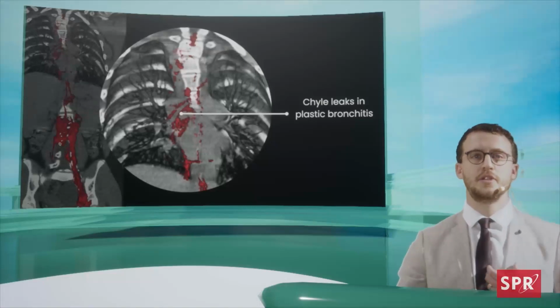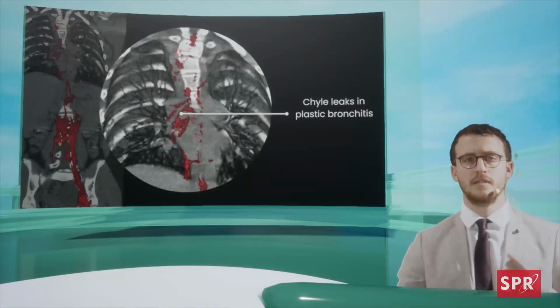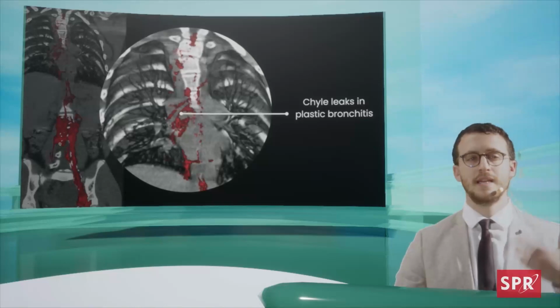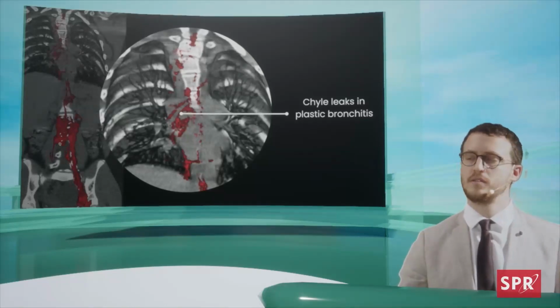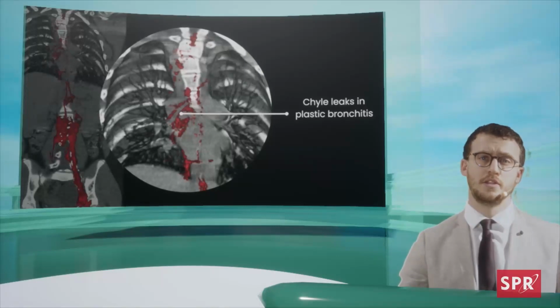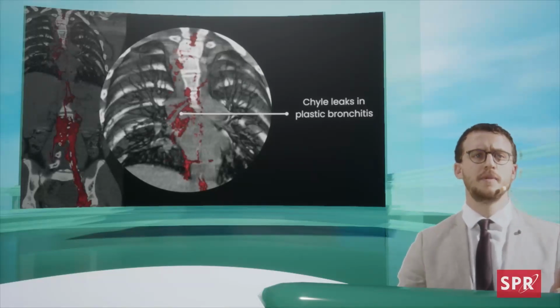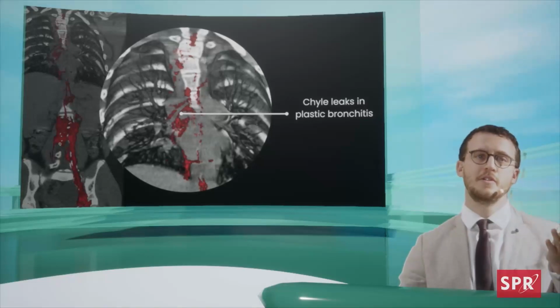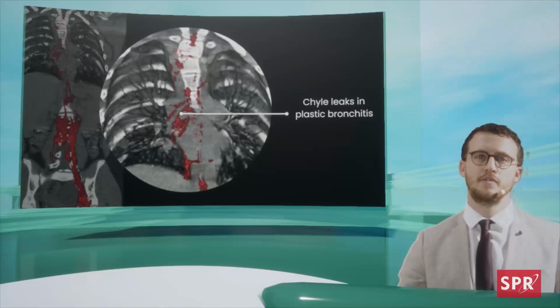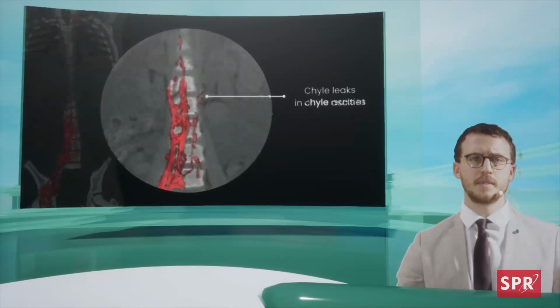had a cardiac surgery for a correction of Fallot disease. And 10 years afterwards, she started with plastic bronchitis. That is another complication that's common in chest and heart surgery. So we performed a CT lymphangiography, and we got to see contrast around the bronchi. That might be the answer to what's happening with her.